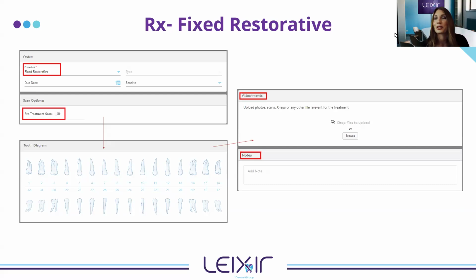The key thing to note here is you can't do it directly from your scanner. So you will have to go to myitero.com, and you can do this from your phone or your desktop, wherever those, let's say, photos are being stored. So you'll select from myitero.com this browse button here. You'll select your photos and you'll upload them. Then you'll go back to your scanner to send.